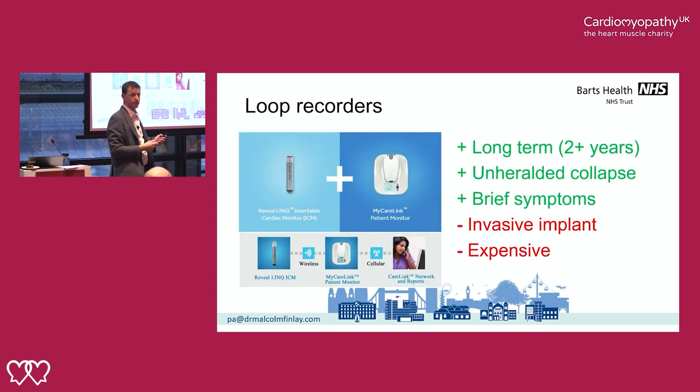And that's a true story. And these are the implantable monitors. This is the sort of thing for someone who has a blackout and loses their ability to do something. You won't have a chance to check your ECG on your watch or put a patch on, take your pulse, take your blood pressure, this sort of thing. You need something that is there the whole time.